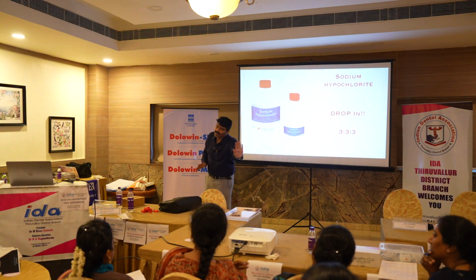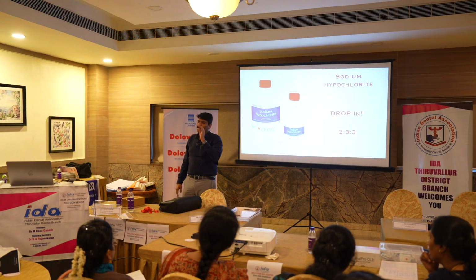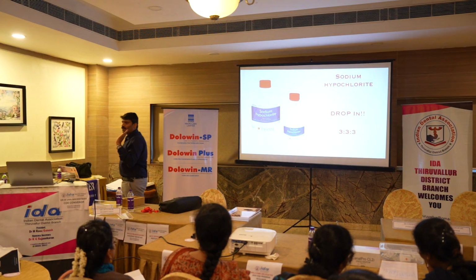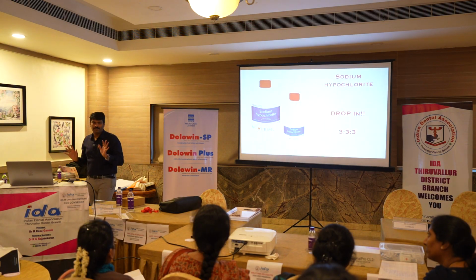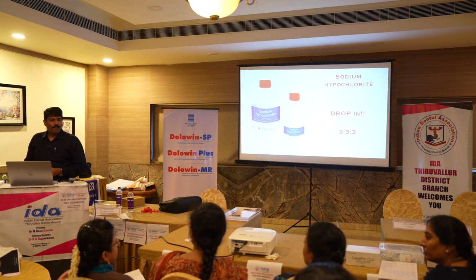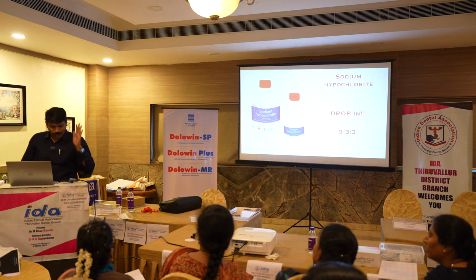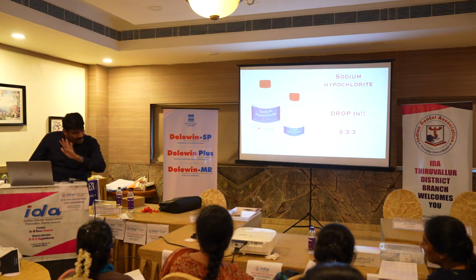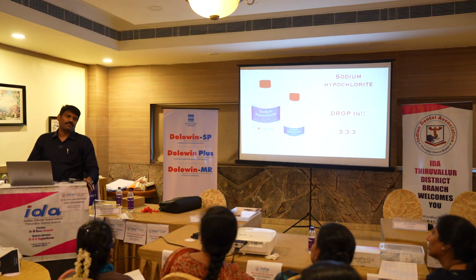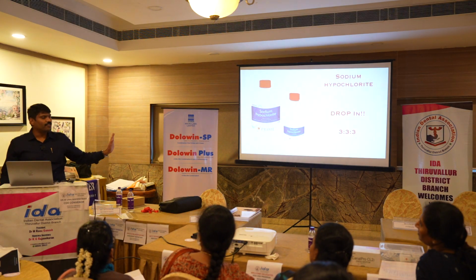Drops will not irritate at all. If you flush, it will. Drop is drop. I am telling you, drop it. You don't flush it. Drop it. 1, 2, 3. Can you show me one case with sodium hypochlorite? Accidents are there. In a permanent tooth it is very small, we cannot see at all. There may have been problems at the developmental stage. There is no proof. Now people are irrigating also, but I advise you to go for drops.